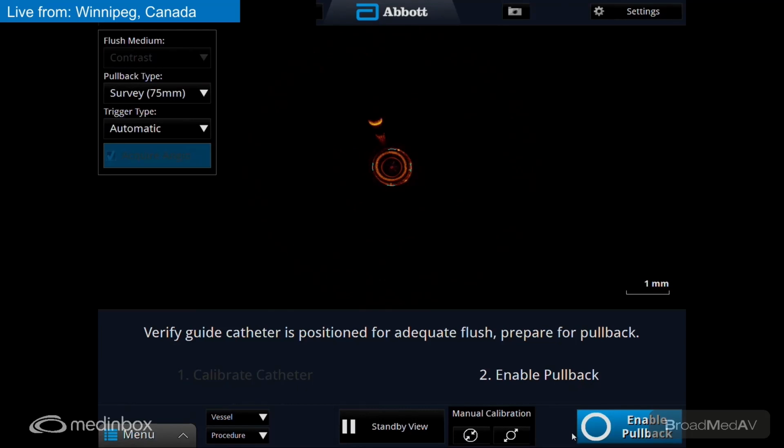Perfect. Let's give this a go with the freshest OCT that we have. It's getting stuck on something there. I got it. All right, you got the nice.